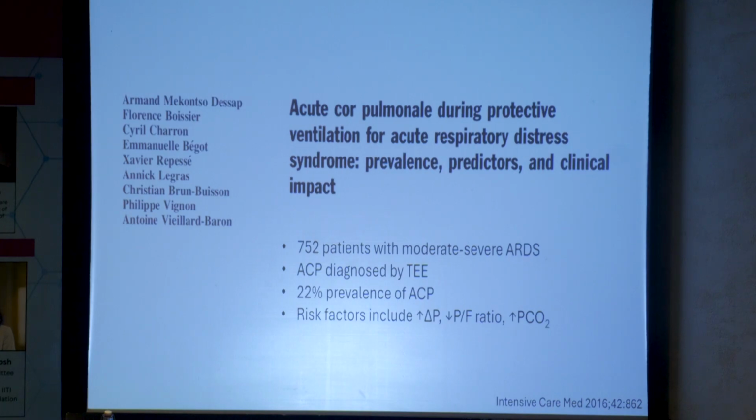We have done this experiment. There are times, I used to do a VA ECMO cannula prior to organ harvest. And I still remember one patient, we kept trying, and later on we found out the patient had an IVC filter. So I tried to get past the IVC filter. So we won't go there. Yeah, and a common situation is that you have a patient in the ICU with a right IJ triple lumen catheter.